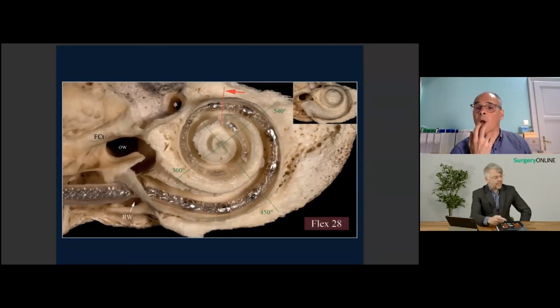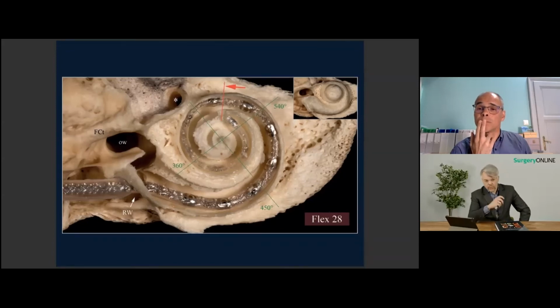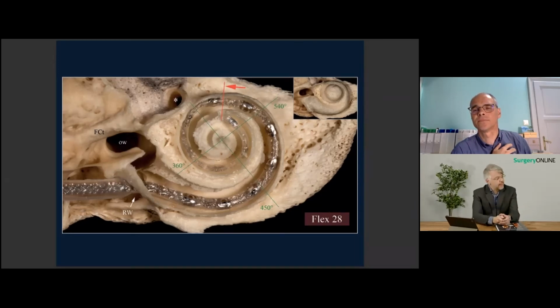Very good. So to summarize, in order to have a smooth insertion with structure preservation, and maybe also hearing preservation, if the patient has it, knowing the anatomy very well and the histology is very important, just to choose the right spot, to drill out the right spot, understand if there is a mucosal fold or the real tympanic, the round window membrane, and then insert the electrode with the proper angle, right? Very good. Let's see whether there are some questions in the chat.